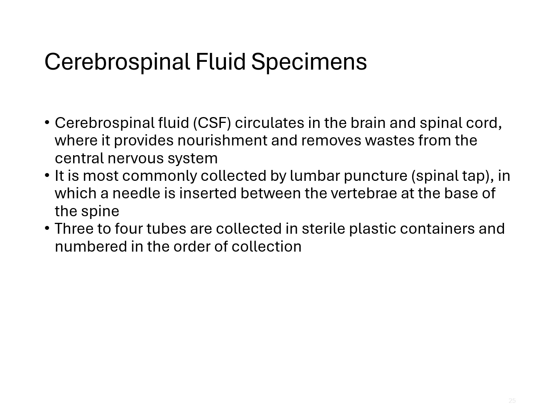Which tube the laboratory department gets is determined by the policy of where you work. Like I mentioned earlier, they are labeled 1 through 4. So that is very important. And then it's really going to depend on your policy and procedure which department within the lab is going to get number 1 or number 2. The spinal fluid specimens are always delivered to the laboratory immediately and are analyzed as a stat collection.